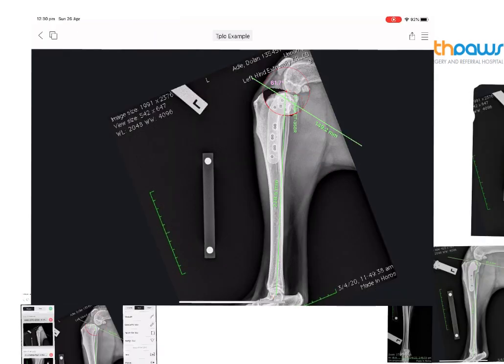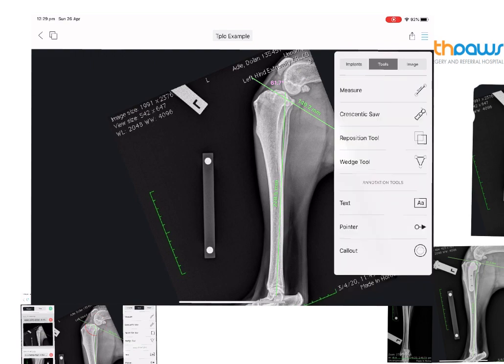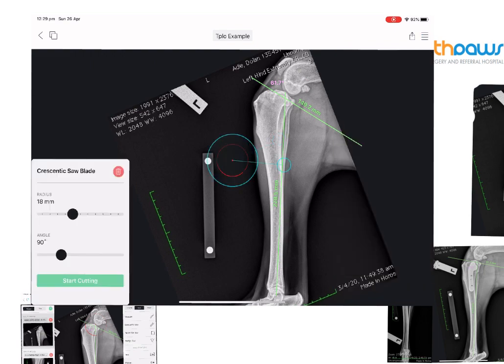The next part of our plan is to work out where we're going to make our osteotomy and what size saw blade we're going to use. We want to develop measurements from our x-rays so that in surgery we can place our osteotomy accurately. We're going to use planning software called VPOP Pro. We've calibrated our image with calibration markers and have already worked out the tibial plateau angle.